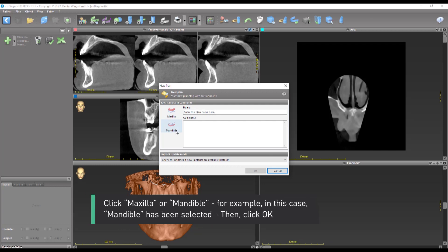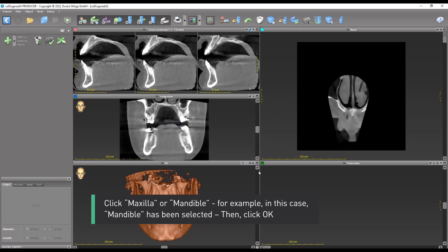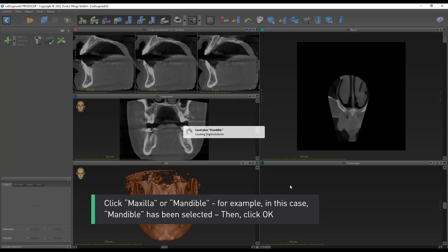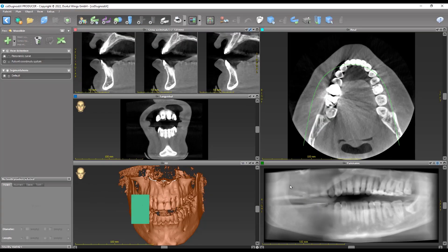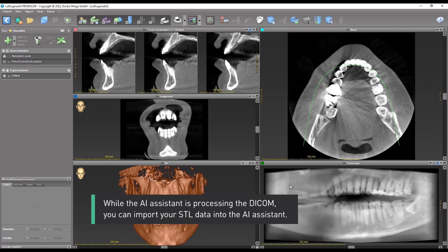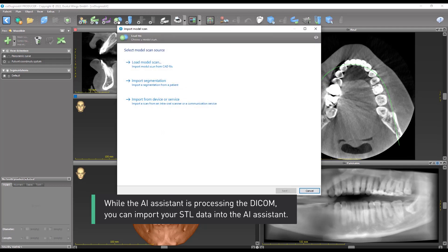Click Maxilla or Mandible. For example, in this case, Mandible has been selected. Then click OK. While the AI assistant is processing the DICOM, you can import your STL data into the AI assistant.